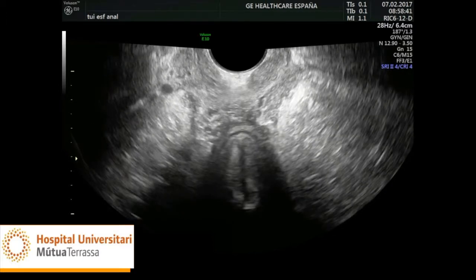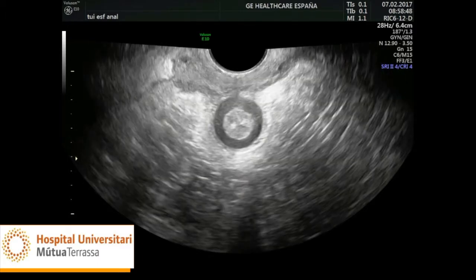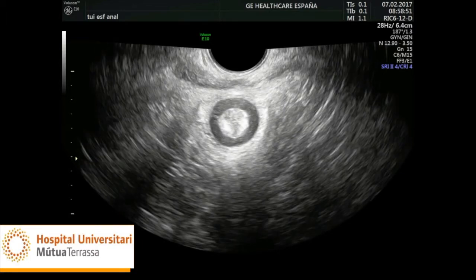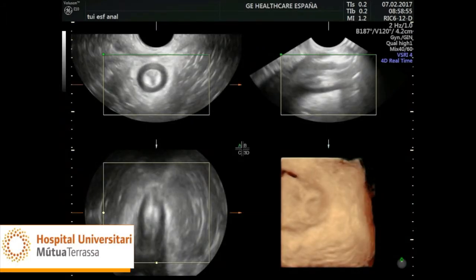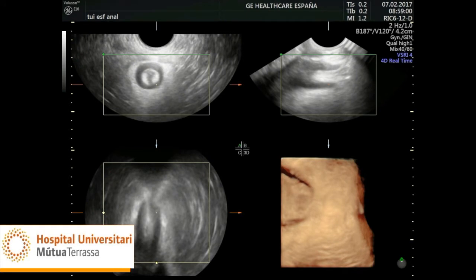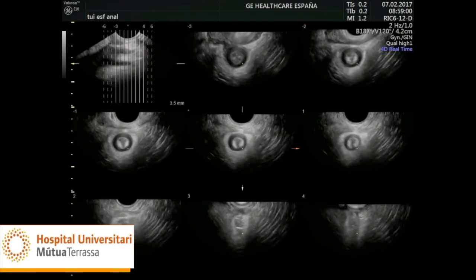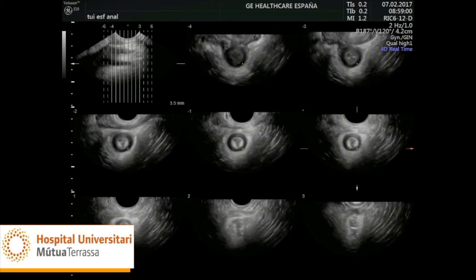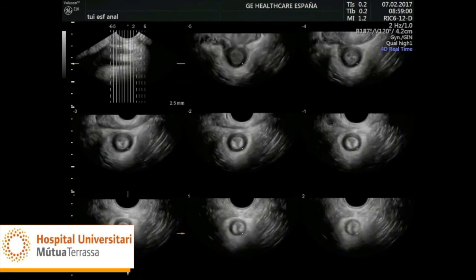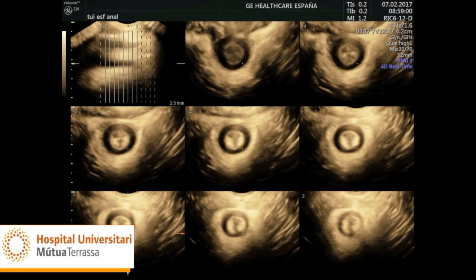For transperineal anal sphincter studies, we rotate the transducer 90 degrees for the two-dimensional image of the sphincter, activate 4D ultrasound, and ask the patient to perform the contraction maneuver. Once we have confirmed that the entire anal canal can be properly seen on plane B, we activate the Tomographic Ultrasound Imaging on plane A. The image that we see is that of the anal canal cut along its axial plane, and we can assess the external and internal anal sphincters. In the upper-left image, we can see the level of the cut, and we can include more or fewer cuts, spaced depending on the length of the canal.